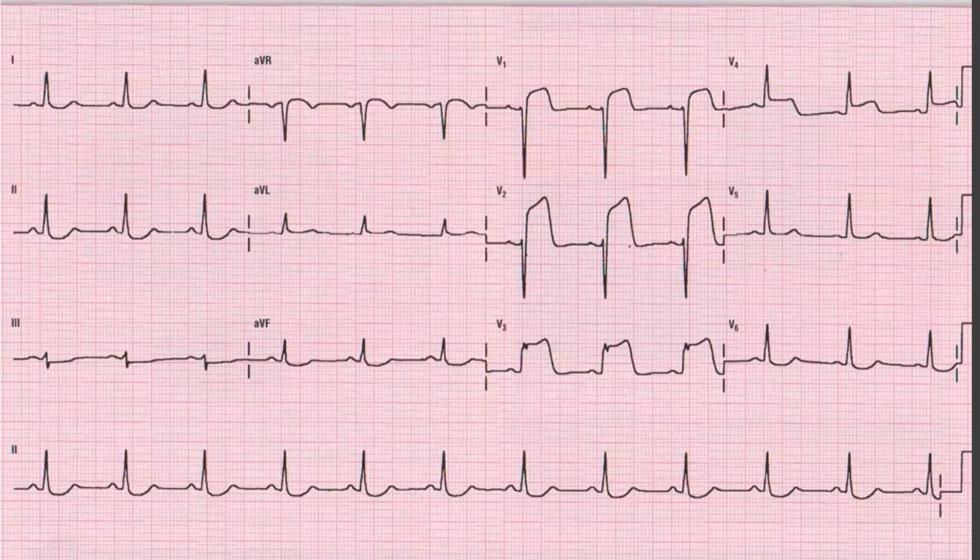Okay, so this is how you responded. And let's see what the correct answer is. All right. So there's ST elevations in the following leads. V1. Do you all agree? There's ST elevation in V2. There's also ST elevation in V3, as well as V4. Normal in V5 and V6.